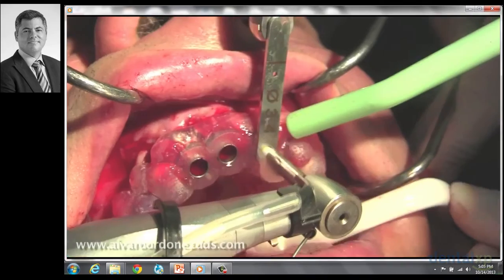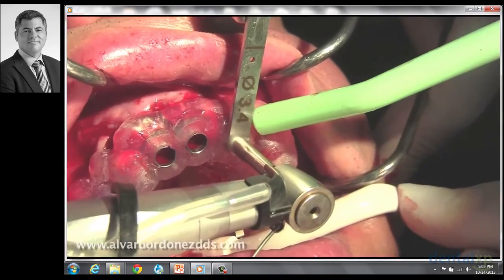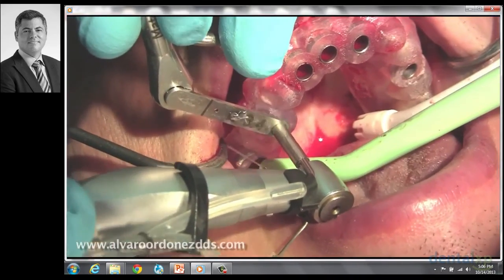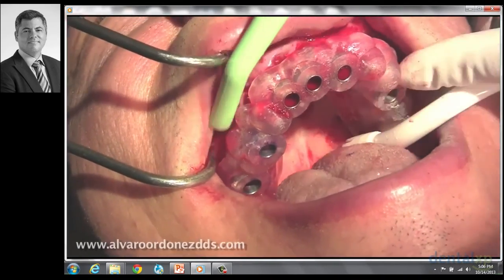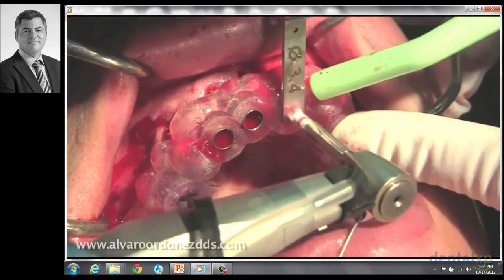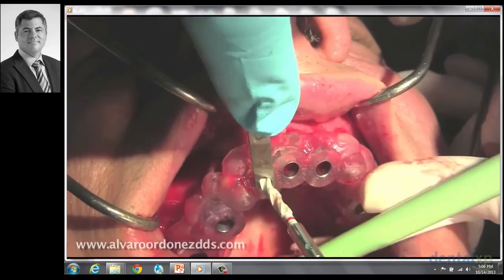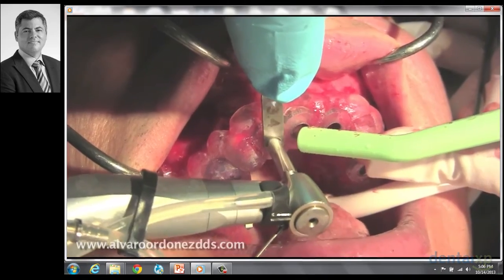So it's a very simple and easy procedure, because all you have to do is get your burr into the sleeve, and follow until you feel that there is a stop. It is a clean and it is a fast way to work. It's a nice system.